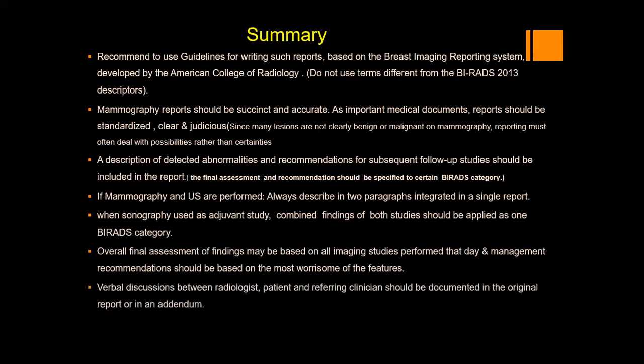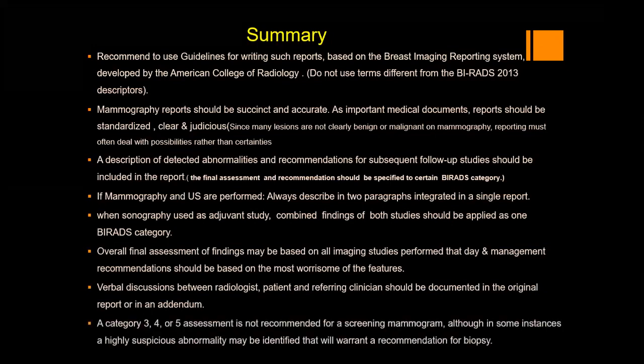Verbal discussion between radiologist, patients, and referring clinician should be documented in the original or addendum report. A category 3, 4, or 5 assessment is not recommended for screening, although in some instances a highly suspicious abnormality may be identified that will warrant a recommendation for biopsy.